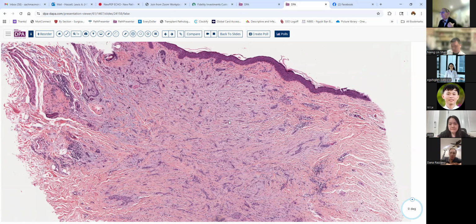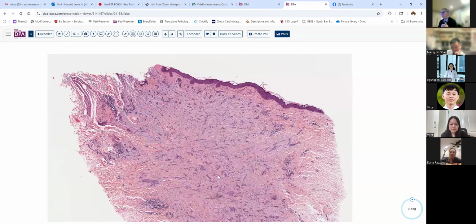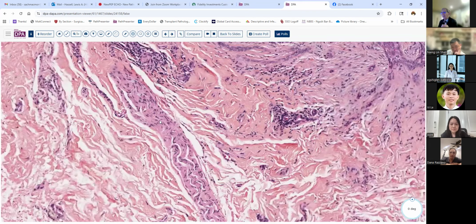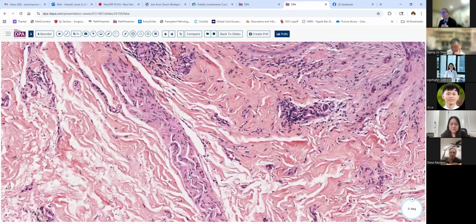And as V said, a sclerosing or desmoplastic melanoma. That very commonly has more spindly cells and so forth, and looks a lot like a scar. But then when you start looking down deep at the nerves like this, you see the cells growing along the perineurium.